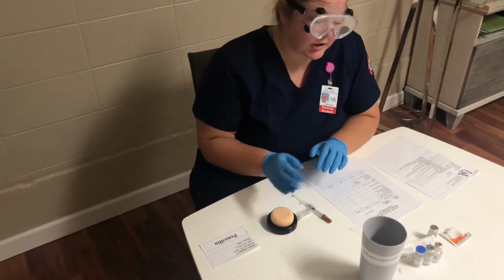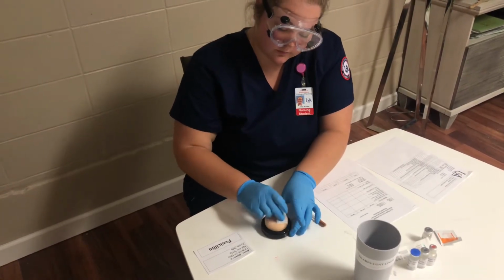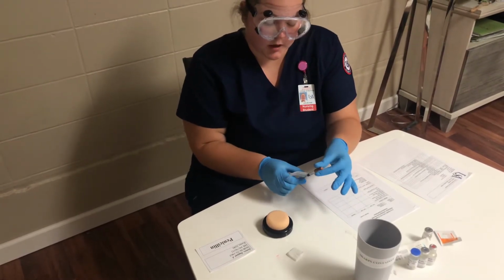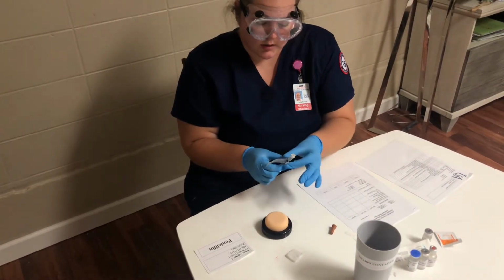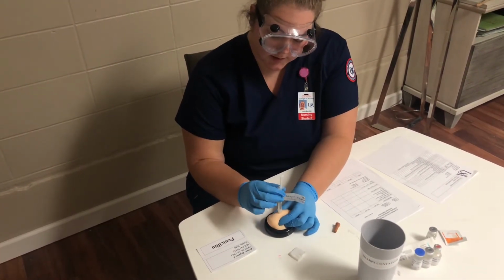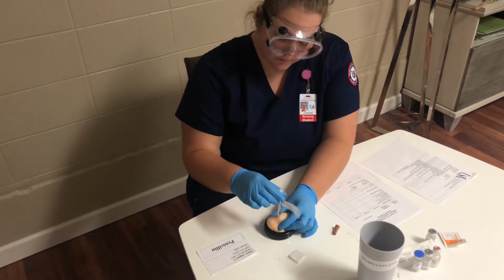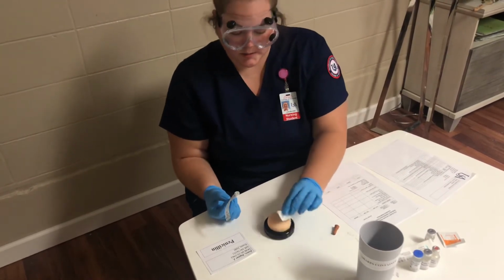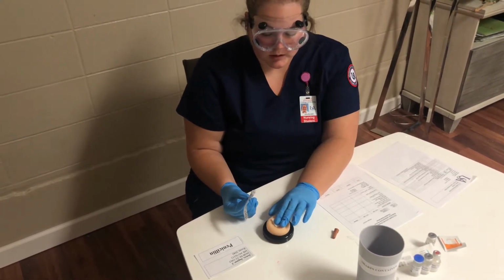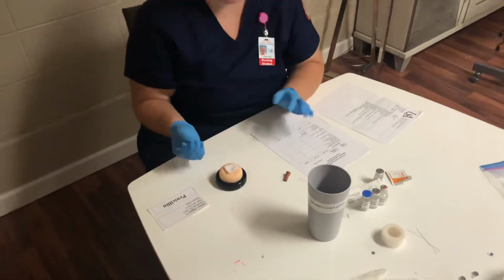I'm going to clean the injection site with an alcohol swab in circular motion. I'm going to uncap the needle. I'm going to pinch up the skin, inject at a 90-degree angle. I'm going to immediately apply light pressure, making sure I don't massage. I'm going to pull up the safety on my syringe and dispose of it into the sharps container.